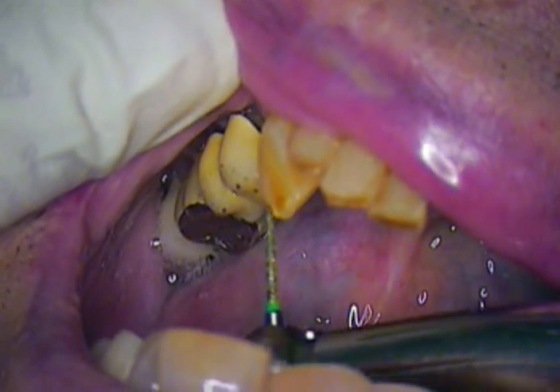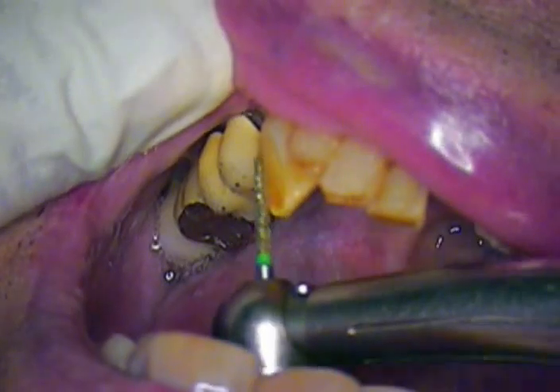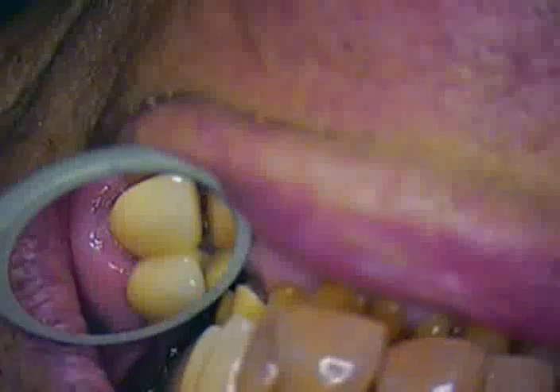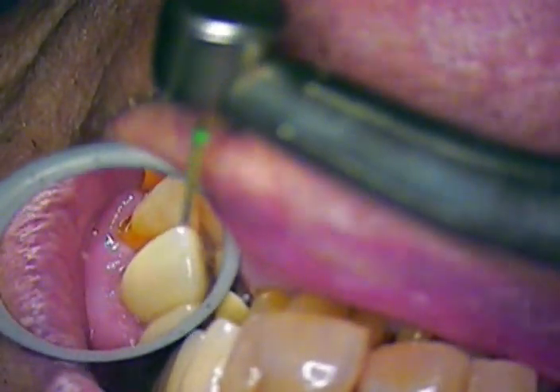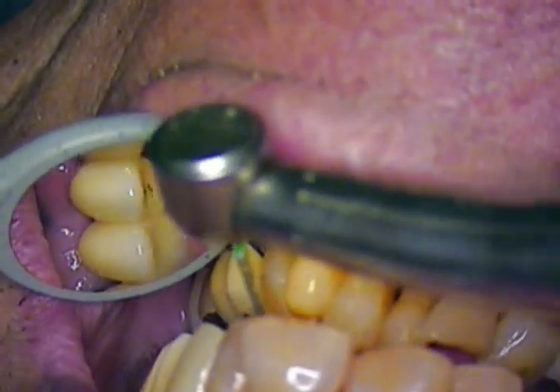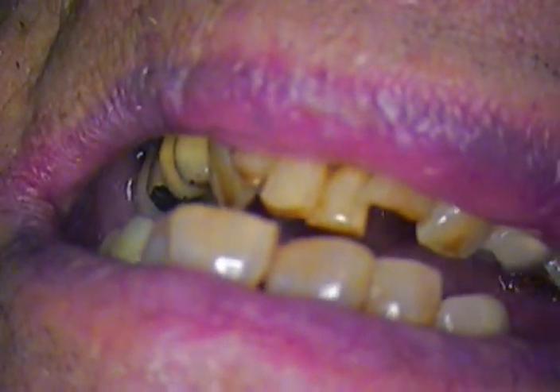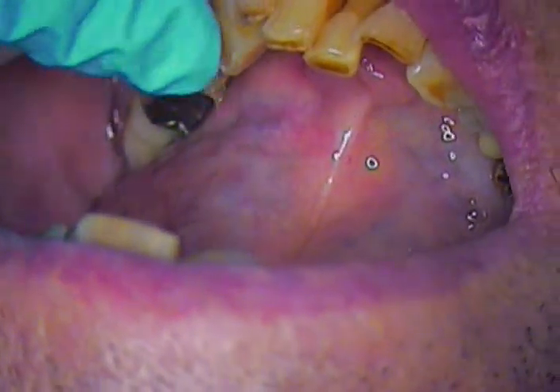We're going to add a layer of composite down here, hopefully bonding as much as we can to this enamel. We'll end up with material filling the void and give him something where he can grind left and right on teeth 21 and 22 so that they disclude his left side, keeping the force distributed through those two teeth.